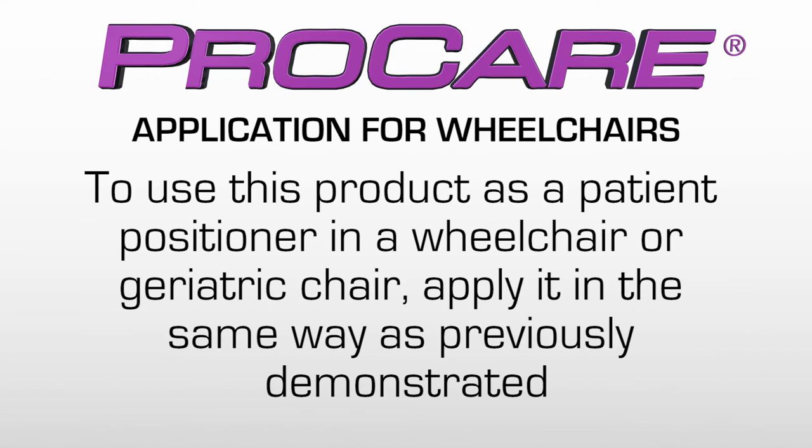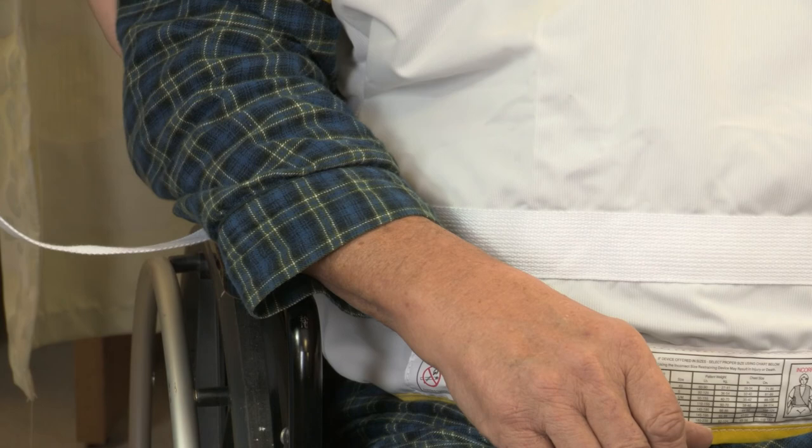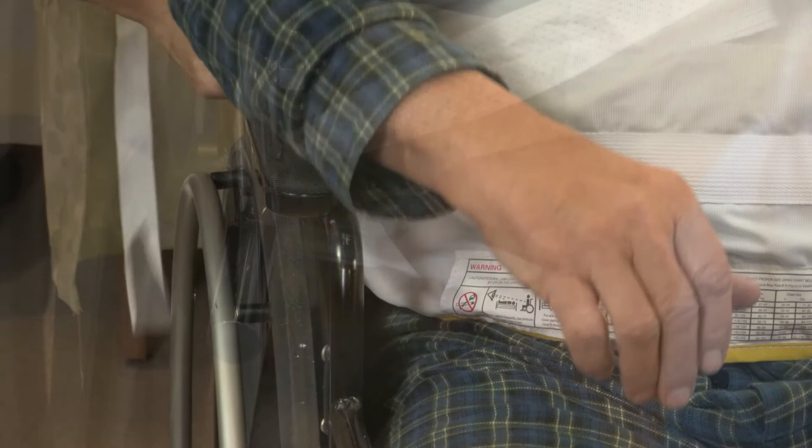If you wish to use this product as a patient positioner in a wheelchair or geriatric chair, apply it in the same way as previously demonstrated. Then seat the patient in the chair. Gather the straps on either side and bring the end of the connecting straps down between the seat and the wheelchair sides. Gather one strap and wrap it tightly around the opposite side kick spur. Take the loose end of the strap and drape it over the tight end strap and pull it through to form a loop.